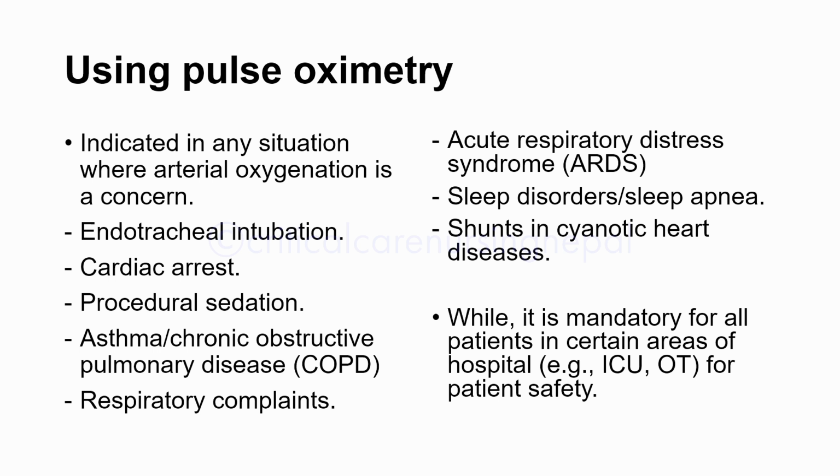And now, can you say what the limitations of pulse oximetry are? Just think of it and we'll discuss.